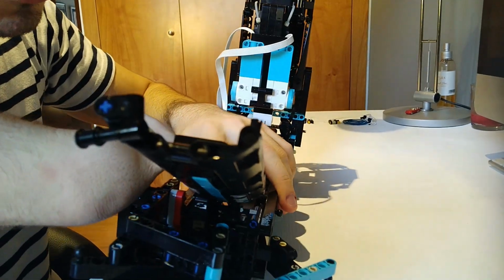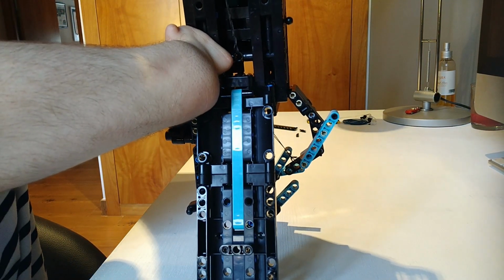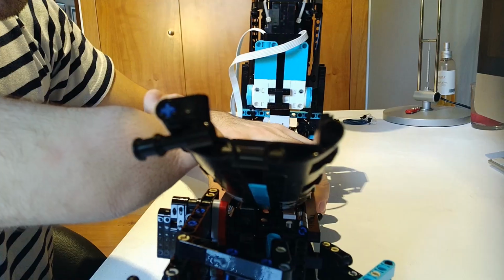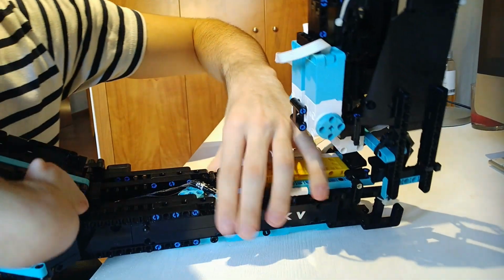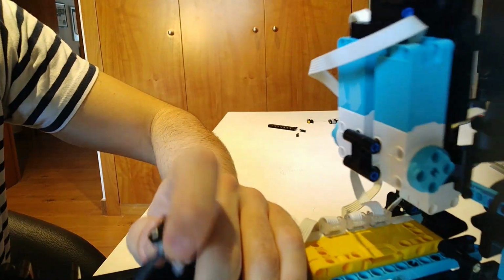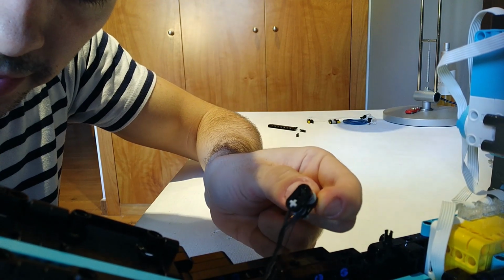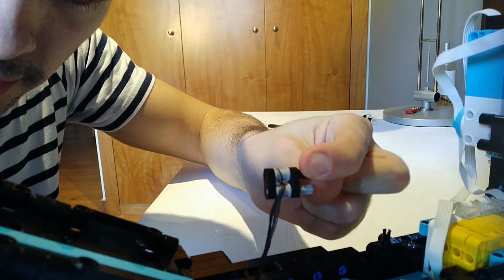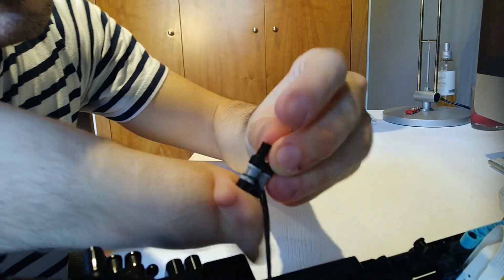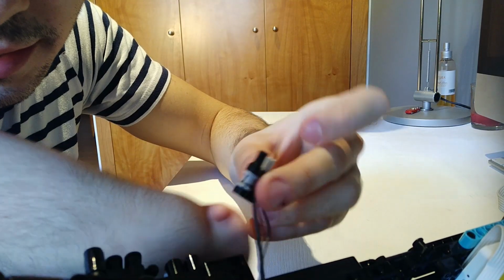As you can see, I'm going to show it to you. There's a hole right here, and you need to put the 5 cables inside so they are centered in one spot. And you'll need something like this. It's a really simple build. I'm going to show it to the camera. So this build consists of 2 bushes, 2 Technic lift arms, 1 gray axle, which is 1x3, and this brick right here, which is 1 pin, and there's 2 axles on the inside.